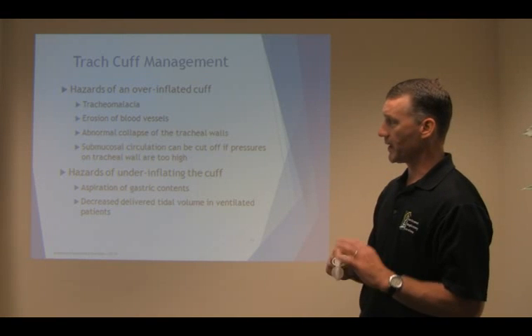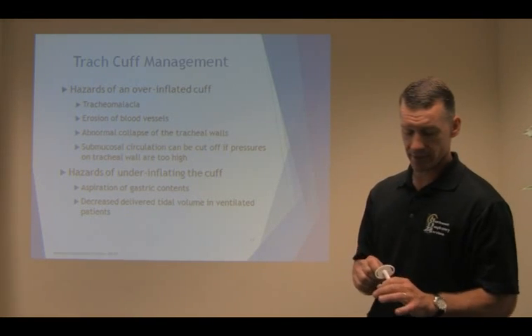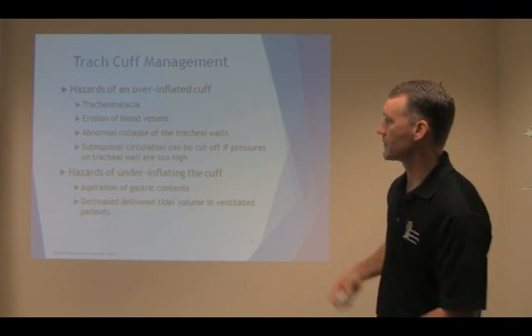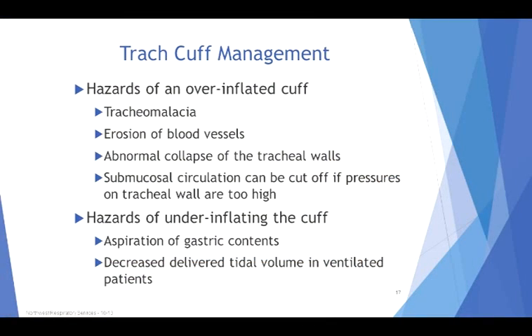So we want to make sure that we don't have too much pressure in the cuff, but just enough to make the cuff sealed in the tracheal wall. So hazards of an underinflated cuff: aspiration of the gastric contents, decreased delivery of tidal volume in ventilated patients.